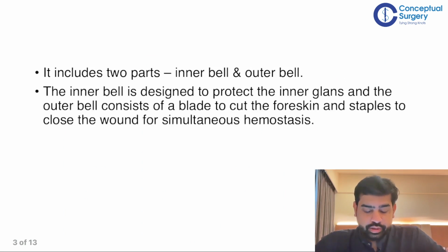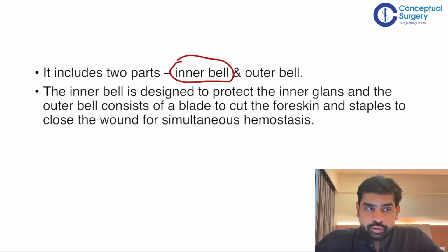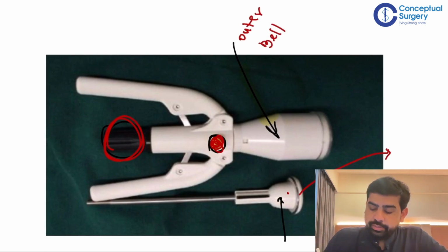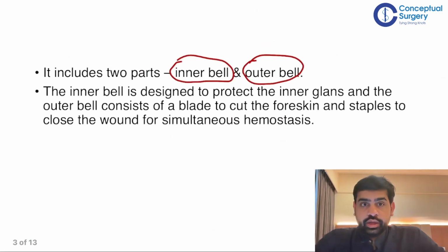Now it includes two parts. The inner bell, the anvil, is basically called the inner bell. What does it do? It basically helps in protecting the glans. So this big body is called the outer bell, and this is your inner bell. The inner bell is designed to protect the inner glans, and the outer bell consists of the blade to cut the foreskin and staples to close the wound for simultaneous hemostasis.